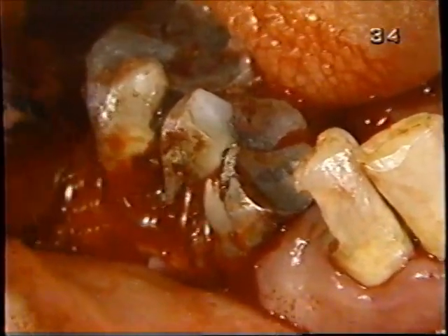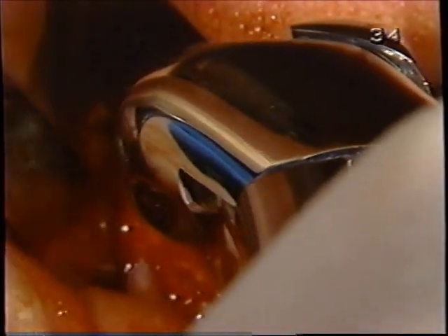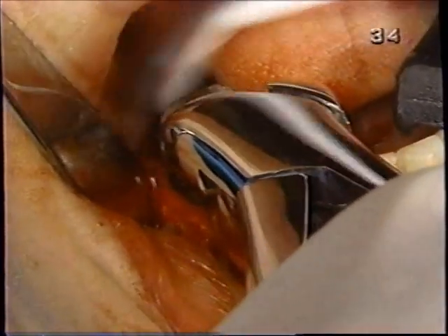So we forego extensive luxation with a straight elevator and go right to a 151. Now, not to use traction forces for extraction, but rather just to luxate, and there the tooth just crumbled.